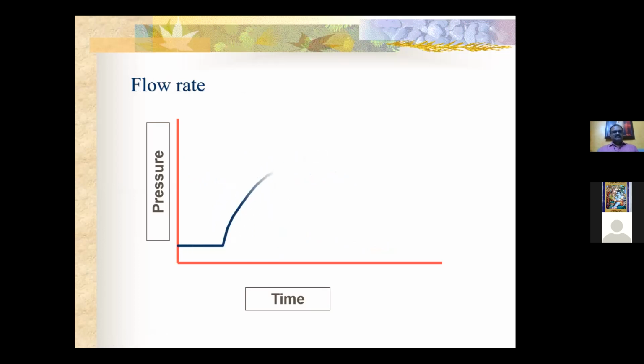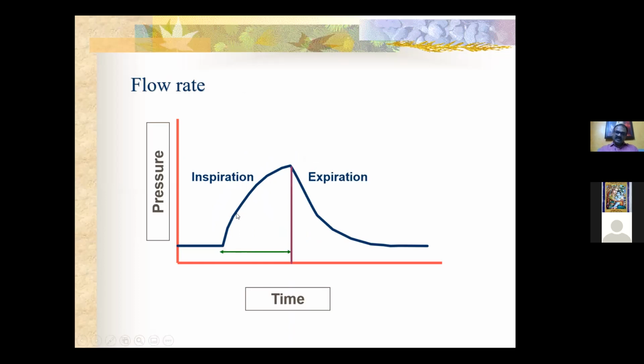So depending on the flow rate, if the flow is very slow, then it will take some time for it to reach the desired pressure.